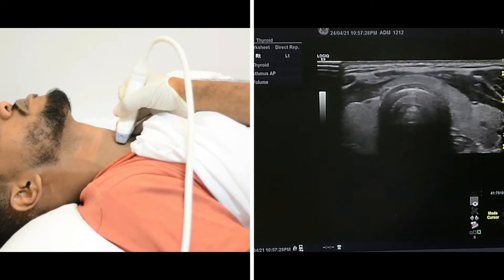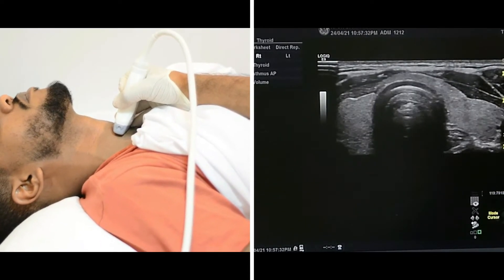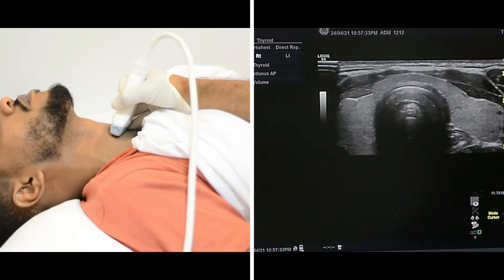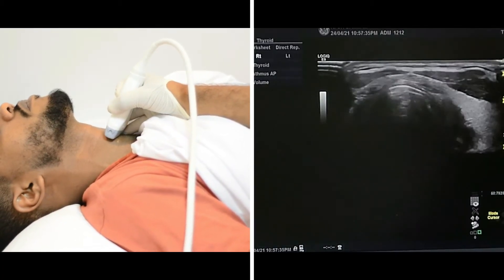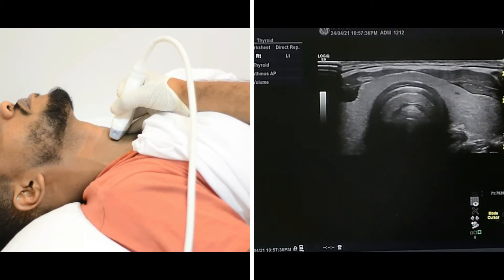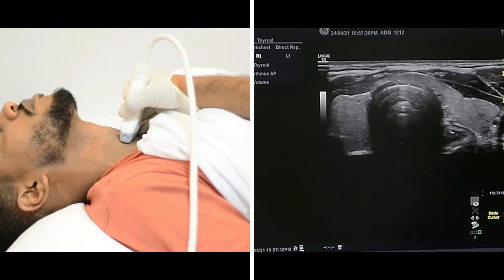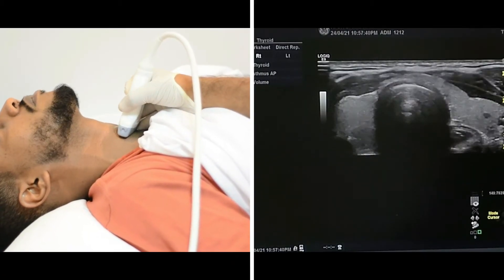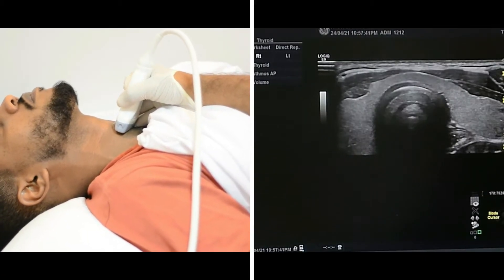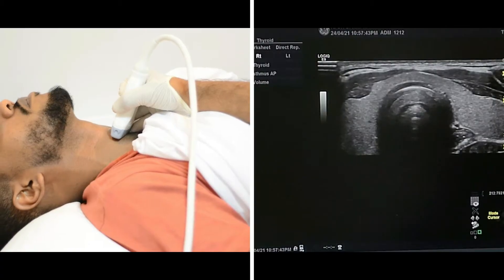We will scan the entire isthmus. I will slide my probe superior and inferior in order to cover all of the isthmus, looking for any abnormality.